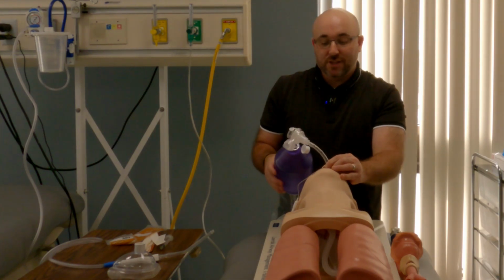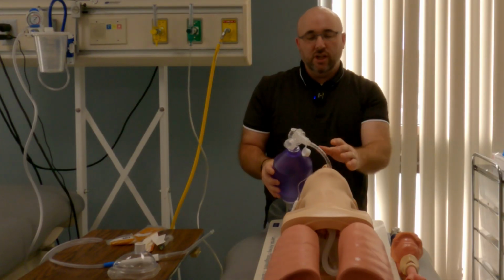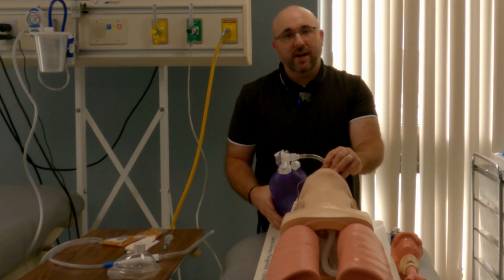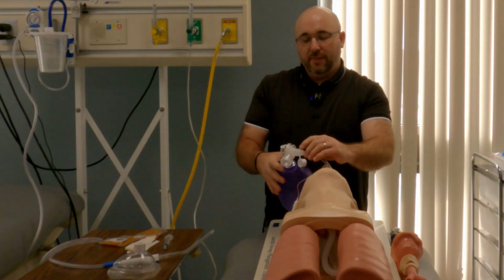After that's all finished, then you can let your hands off once it's secured, and you can ventilate through this, and you don't have to have that extra hand holding that tube in place because you have the securing device holding it there. From that point, you put them on a ventilator. And then you're good to go.